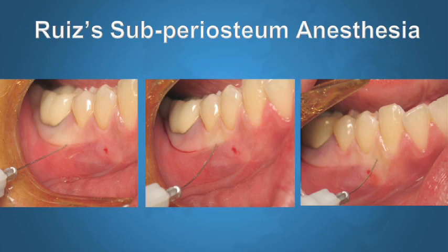And I tell you something, anesthetic is one of those things. I strongly encourage you to use Septocaine because if you use Septocaine, the anesthetic time goes down dramatically. If I use Septocaine on the maxilla, I can start prepping the Class 2 or Class 3 in 2-3 minutes. If I use Septocaine on the mandible, same thing, because guess what? I don't block. I haven't blocked in over a decade.